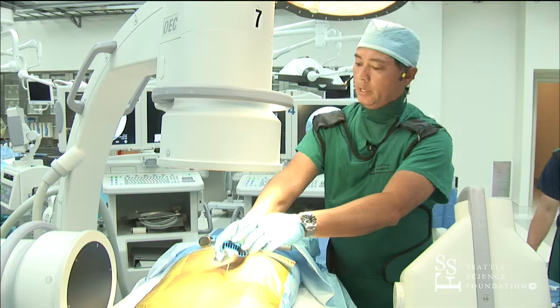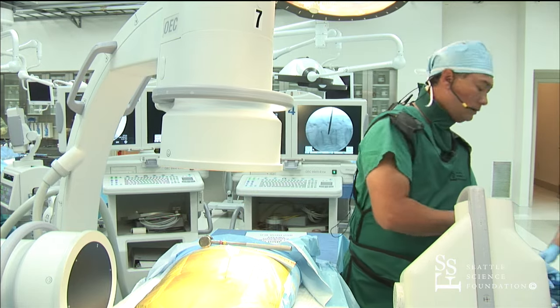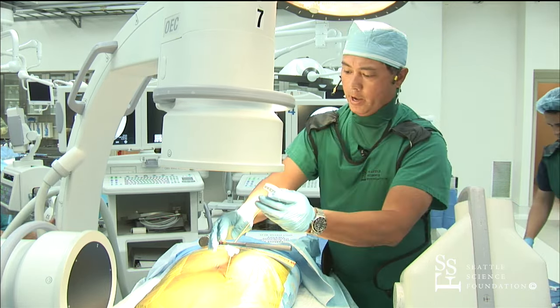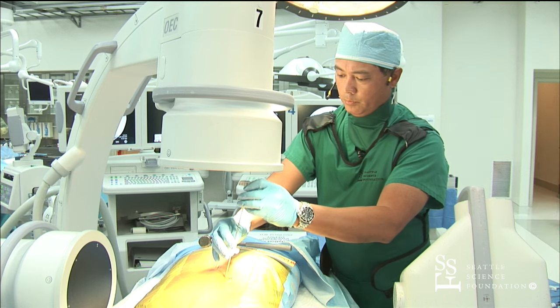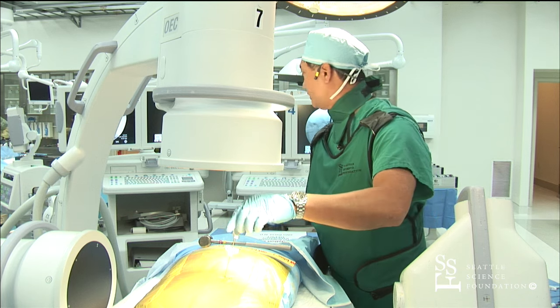At this point, we can use the access drill to help provide some room or cavity — some area for the balloon to exist.